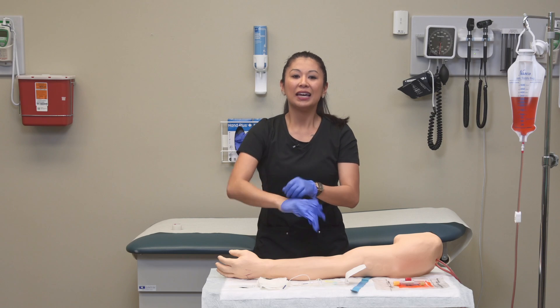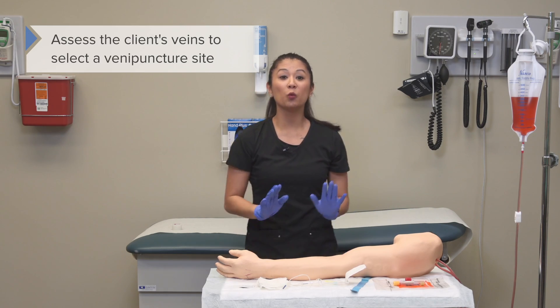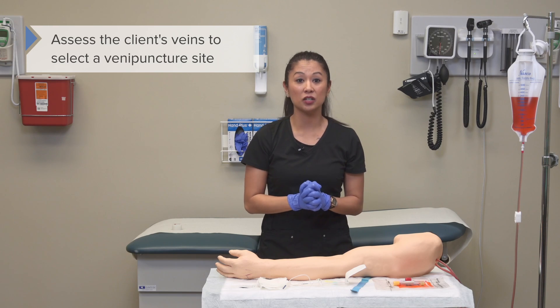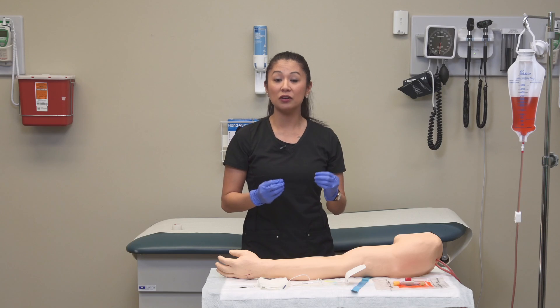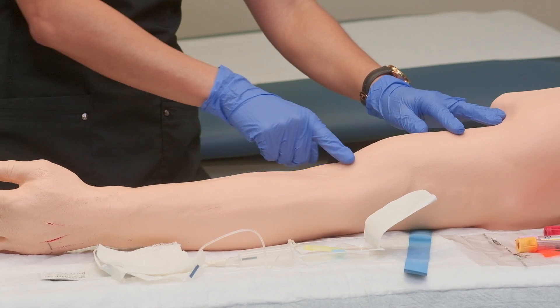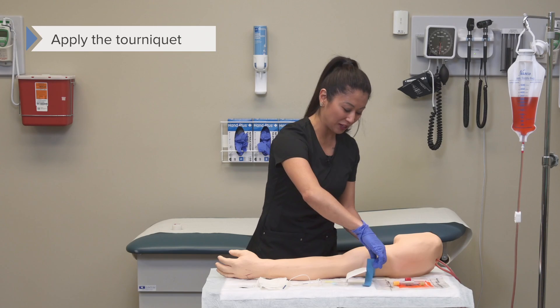When we don our gloves, it's important to assess the client's veins to select which venipuncture site we would like to use. It's very common to use the antecubital or AC site. Now we can go ahead and apply our tourniquet.